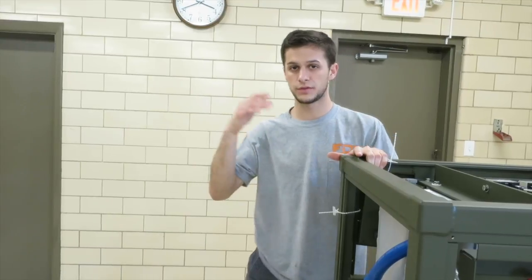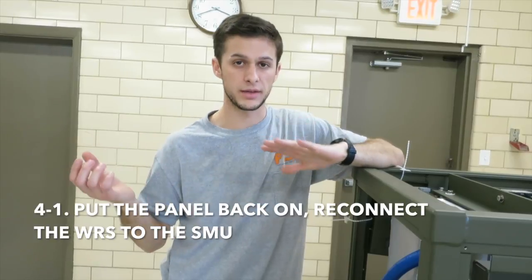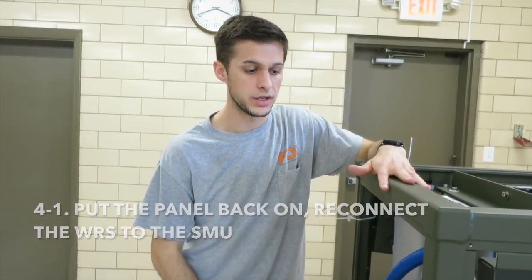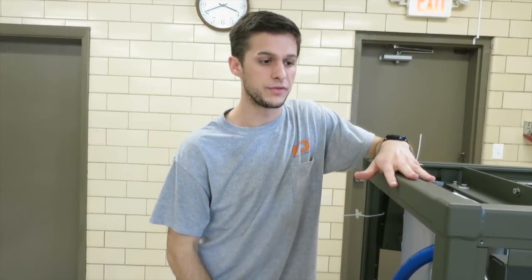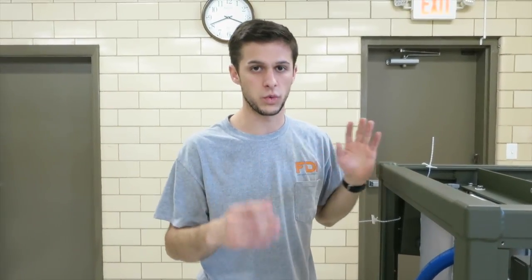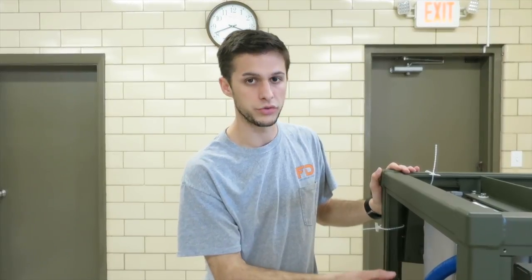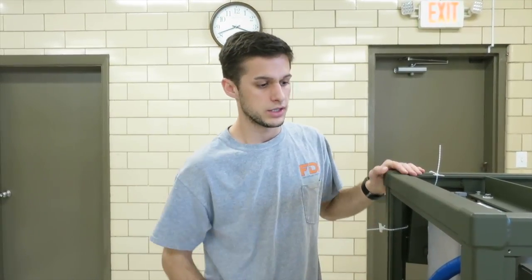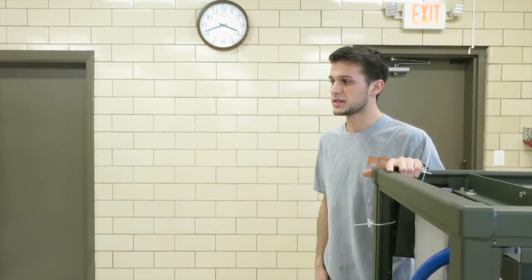Now, the rest of the steps, backtracking 4 to 1, you're going to put the panels back on, hook it back up to the SMU, and turn everything back on. You're going to want to do some verification and validation testing. If you look at the very end of the setup section, there are some tests we recommend just to verify everything's working as normal. But the biggest thing is you should notice that the unit's holding pressure. You're not hearing any blow through, any steam hitting the water in the tank. So that's your check to make sure that the new steam trap you put in is working as it should. So that's it for replacing the steam trap.